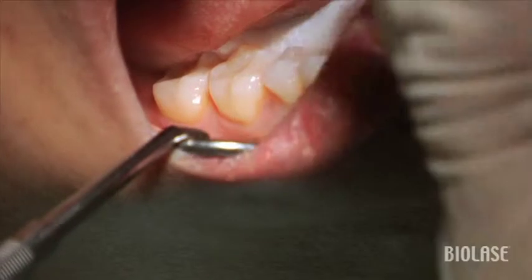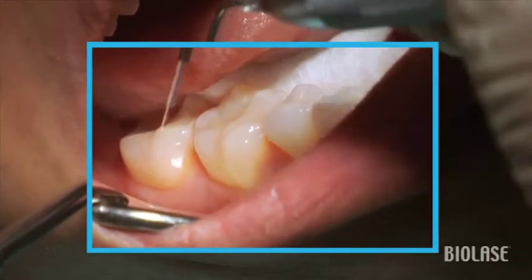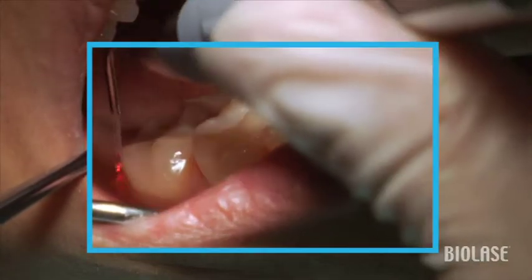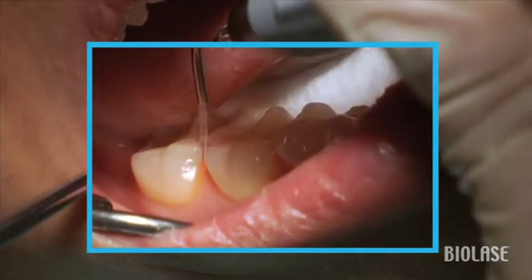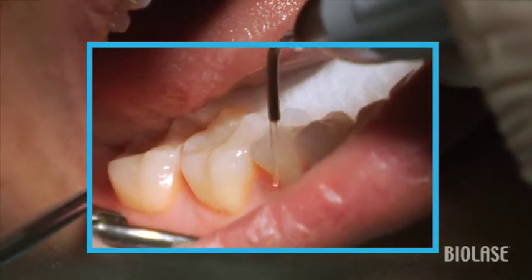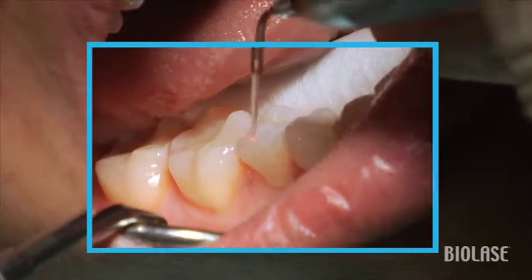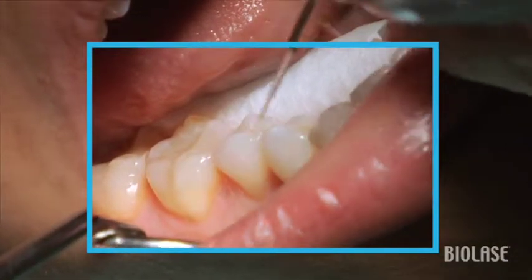So instead, if we're going to go from distal to mesial in this quadrant, we're going to start on the mesial of the molar and work distally, then move to the next molar, start on the mesial and move distally, and repeat this sequence — mesial to distal. In this way, we don't ever end and start in the same papilla, and we don't overheat those papilla, because that would end up generating too much heat and probably causing some of those dreaded black triangles.